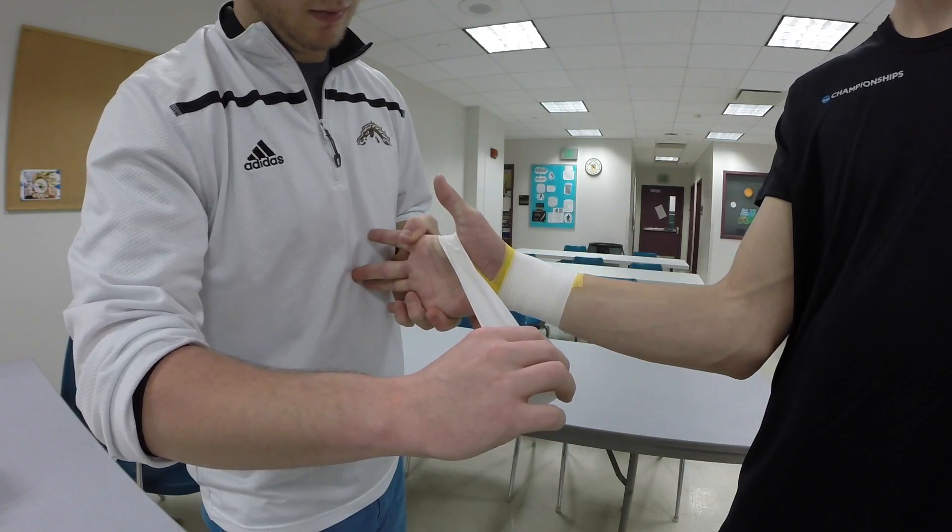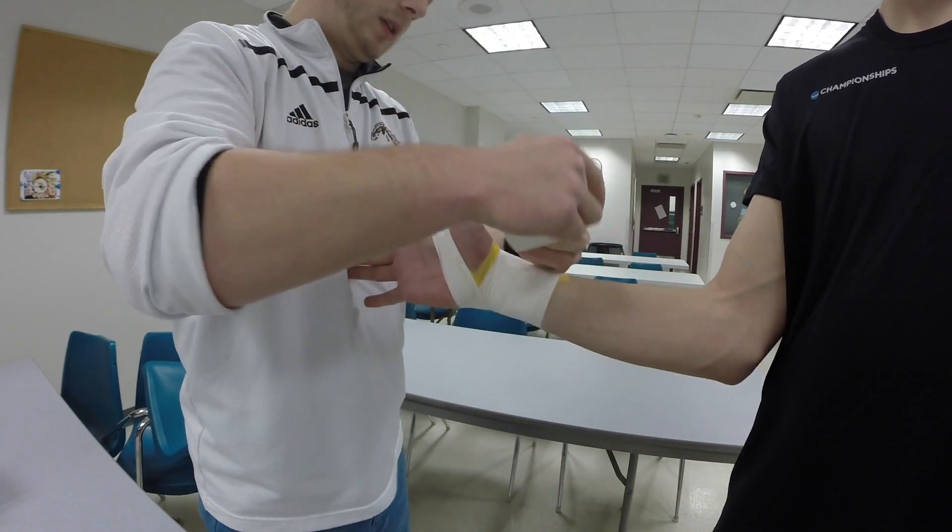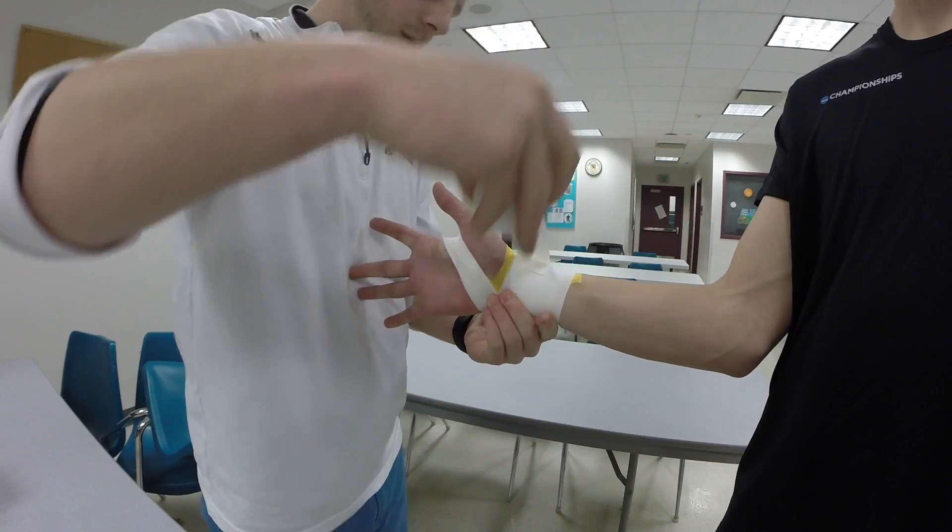This hand position is exactly what we need. Back around the wrist — one rotation, one more.